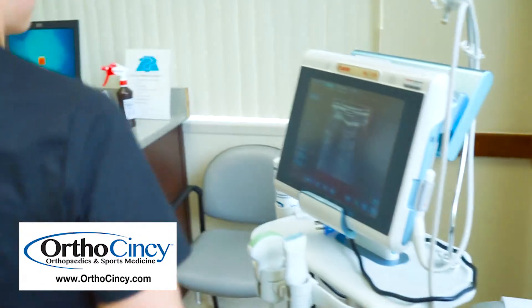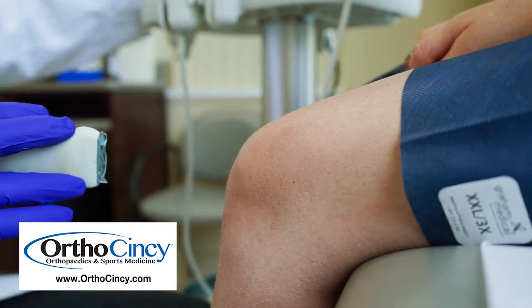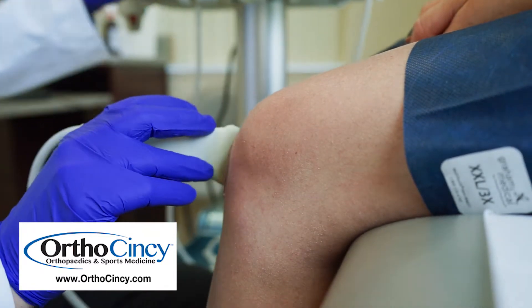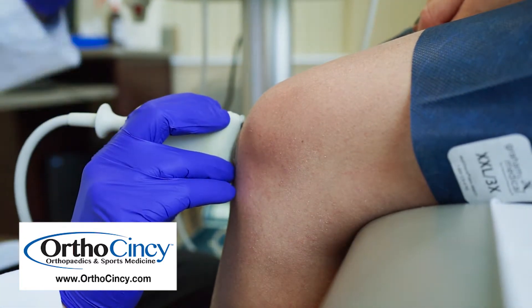An ultrasound machine is a small machine that we can use right here in our office. It's used typically by the physician or one of the practitioners, and it lets us visualize things inside of your body that we can't necessarily see with x-rays.